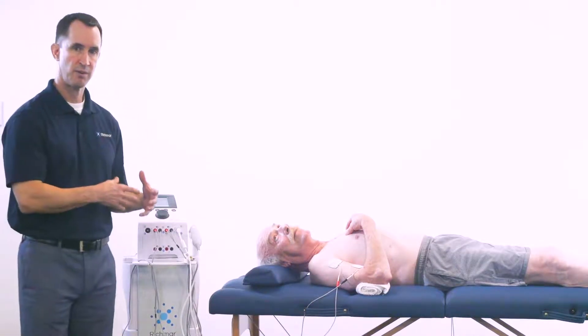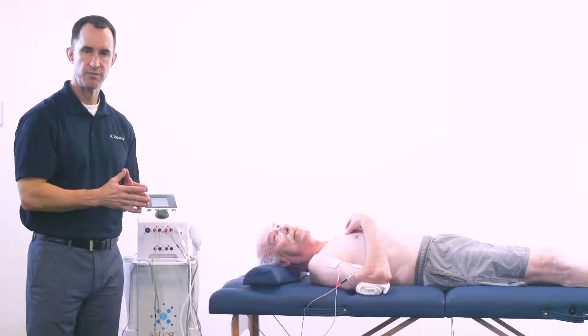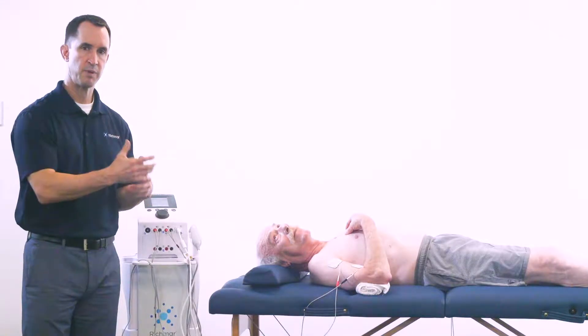The stimulation promotes a decrease in resistance to gentle stretching and allows for improved active elbow extension. I'm going to go ahead and start the treatment, and then I'll transfer over to the stool and work on some passive range of motion exercises that speaks to this protocol.